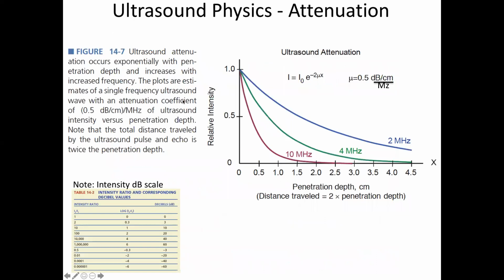Okay. And the other factor is that these pressure waves cause motion in the material itself, so the material is squeezing down and moving apart as the pressure wave goes through, and that will cause the material to heat, okay? And that heat is energy that is lost from the pulse, right?